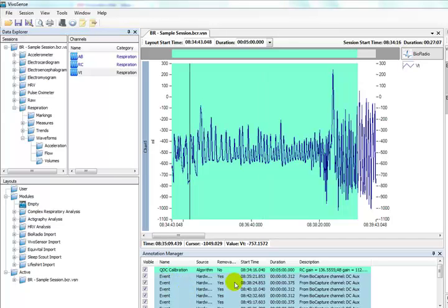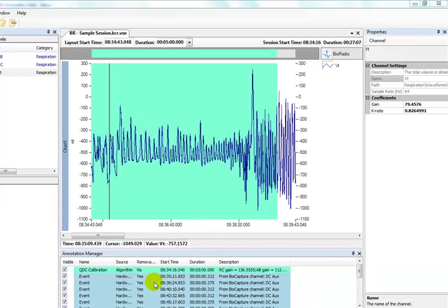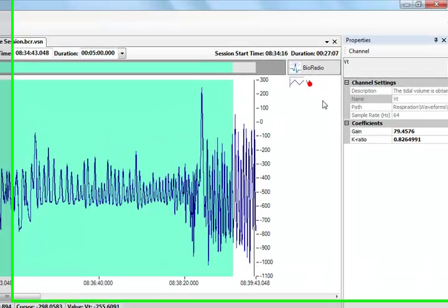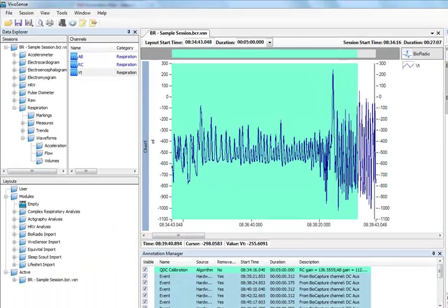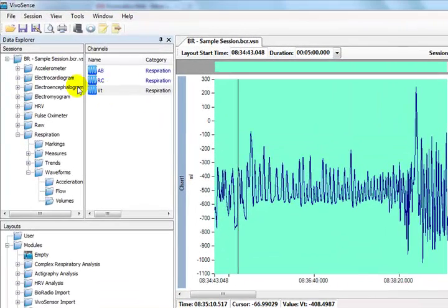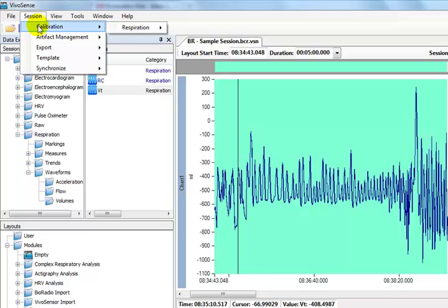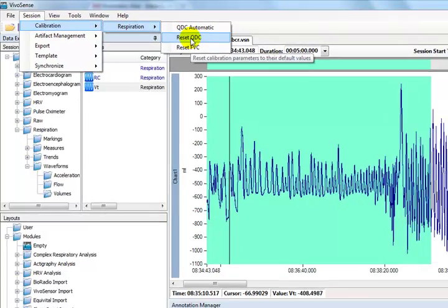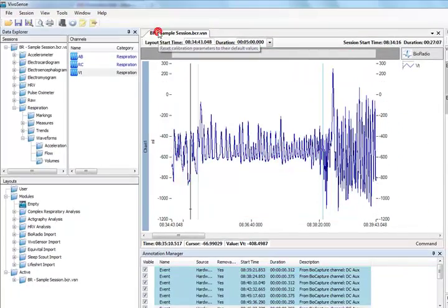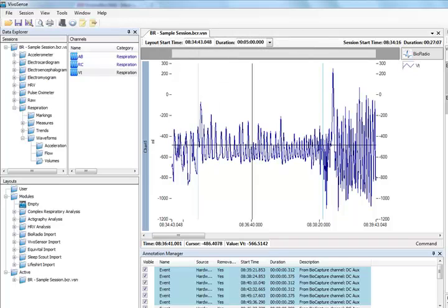If for some reason we are not satisfied with the calibration, we can manually change or override the QDC K-Ratio by looking at the VT channel properties and modifying the K-Ratio here. If we are still not satisfied with our QDC calibration, we can reset the calibration by browsing to the Session menu, Calibration, Respiration, Reset QDC.